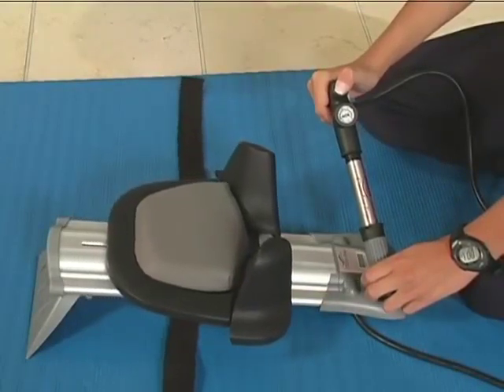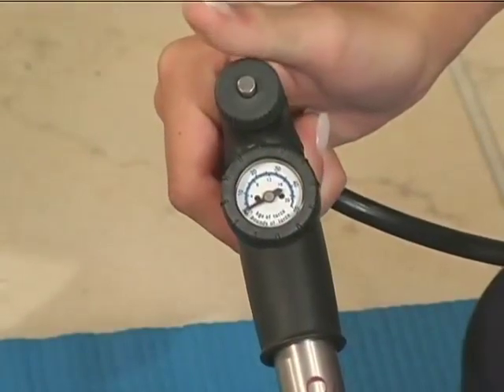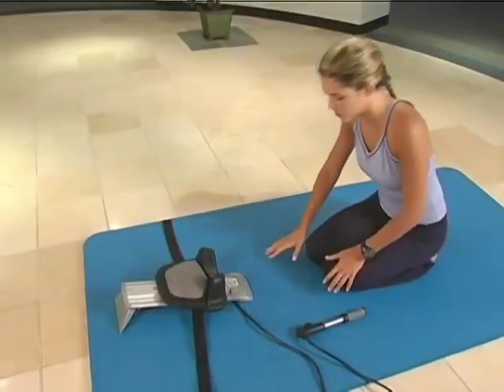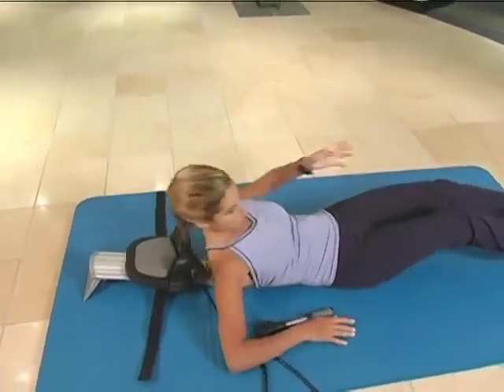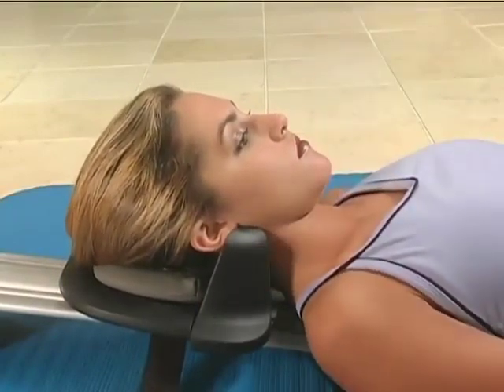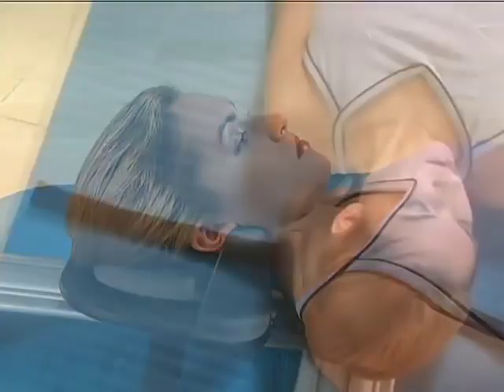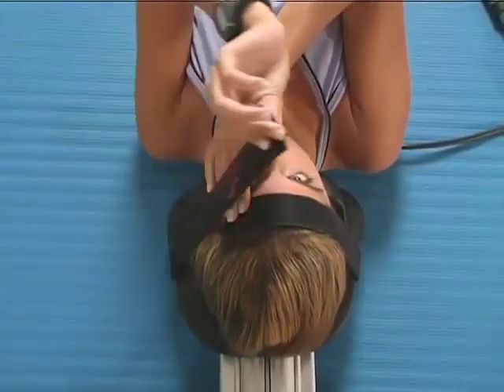Ensure that the head slide is in the starting position by pressing and holding the air release button. Lie down on your back, placing your neck between the neck wedges, your shoulders relaxed, and your head resting comfortably on the head slide cushion. The neck wedges should comfortably cradle your neck. Place the forehead strap around your forehead and adjust for a snug fit.